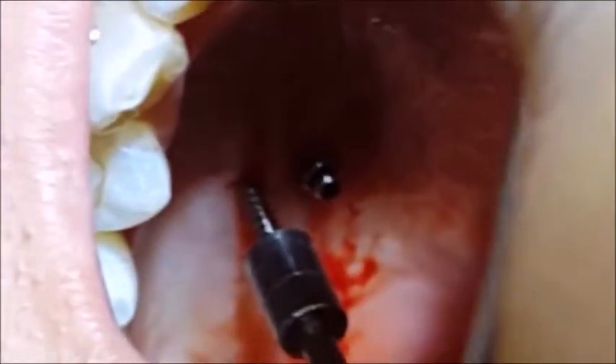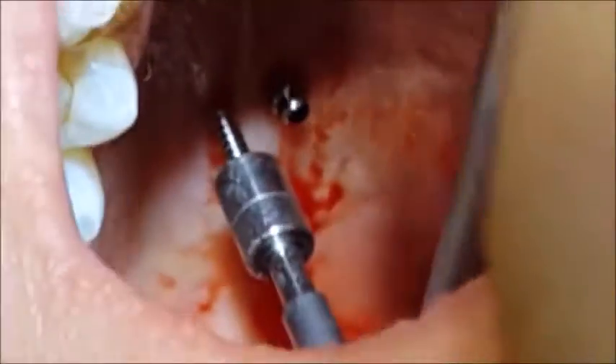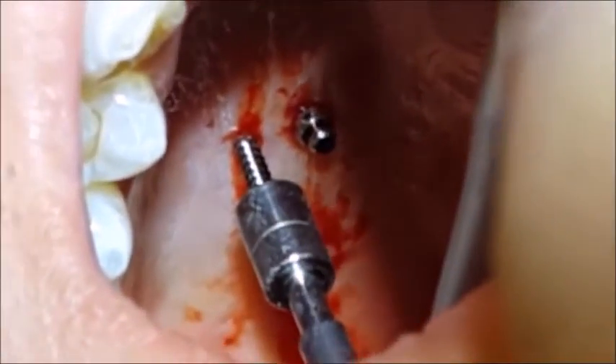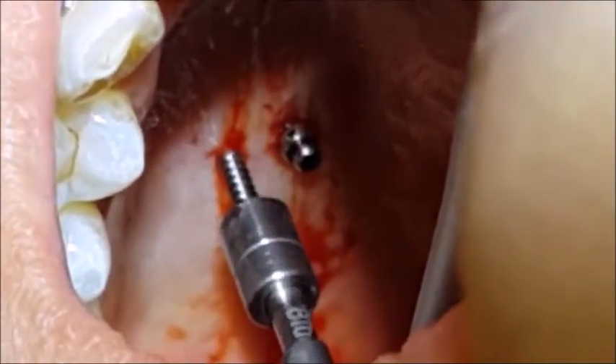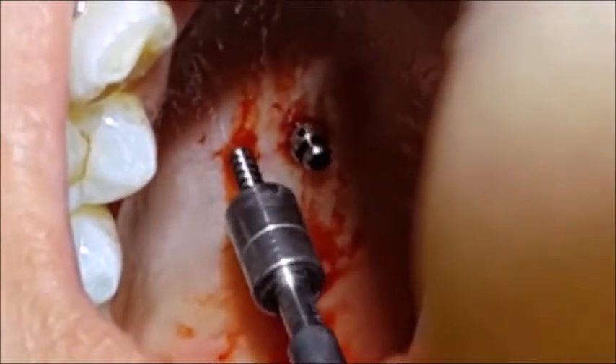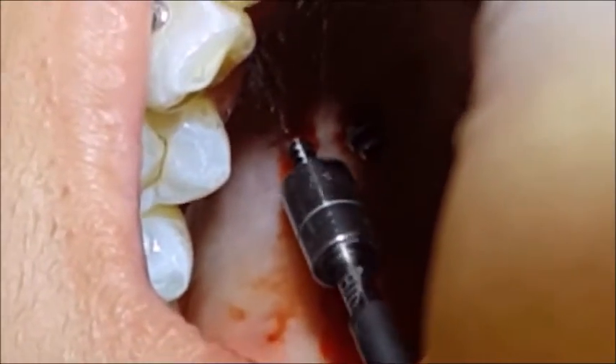The placement of the pin and the contra angle is at 90 degrees to the base of the palate, just lateral to the mid-palatal suture. We will stop the insertion once the contra angle catches the base of the mucosa.